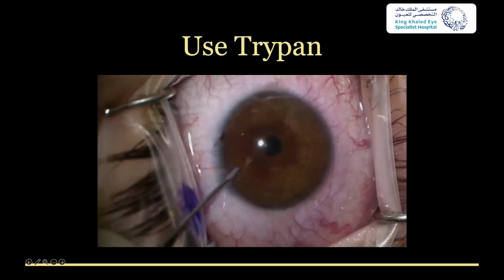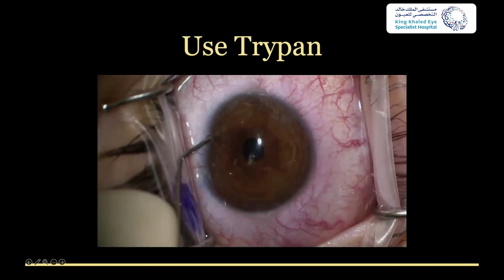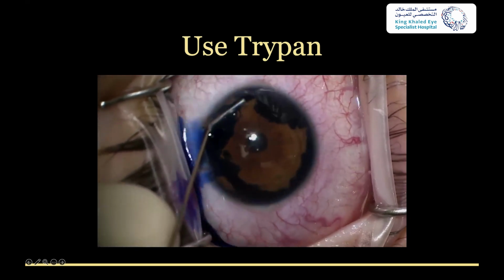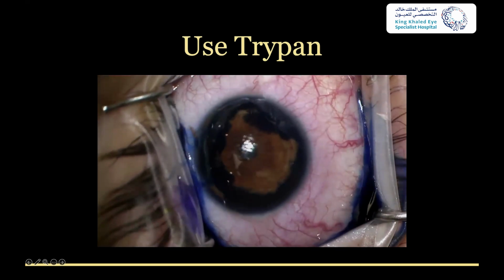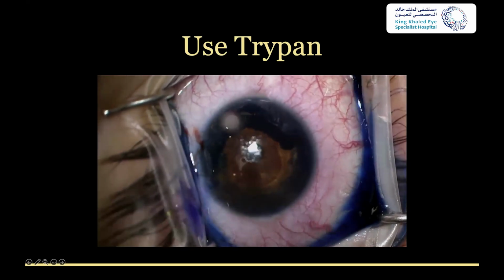And sometimes, if you have a phakic patient, I'll use what I call the blue donut technique, which I'm showing here, where I'm putting a little dollop of viscoelastic material over the lens, and then putting the trypan blue in the actual angle. But no matter what, if you're using trypan blue to stain the trabecular meshwork, you need to give it a reason to stain it. It's unlike using trypan blue for staining the lens, where you just need it in the eye. You actually need the pressure to be up to drive that trypan blue into the angle in order to allow the TM to uptake it.